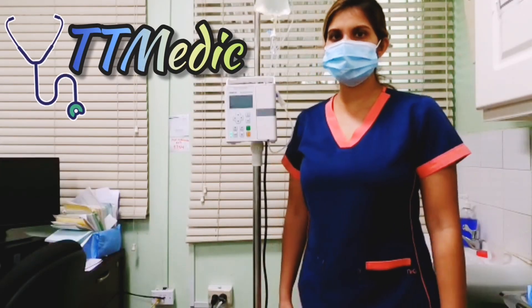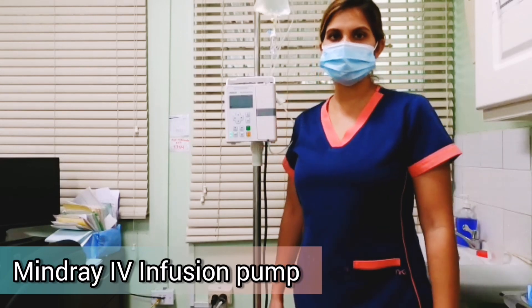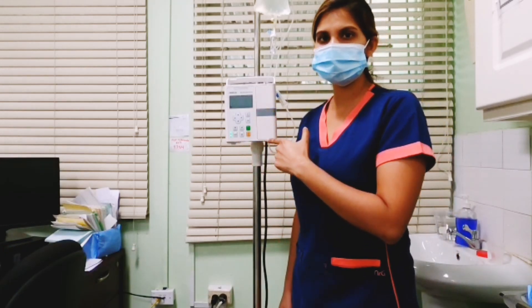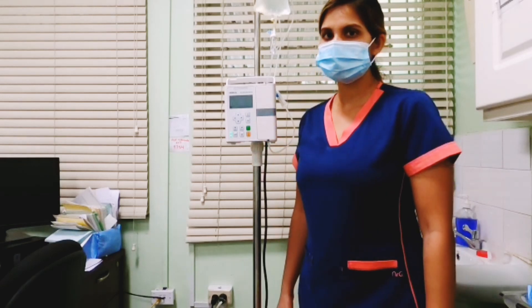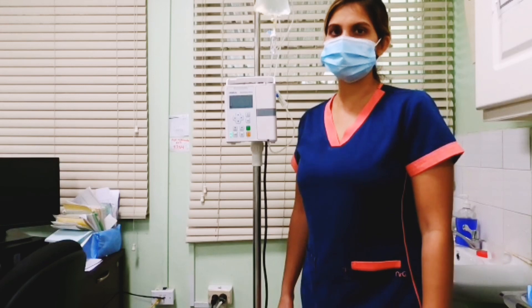Hi, good day. Today we're going to give an instructional video on the Mindray IV infusion pump. We're going to talk about the different functions that they have available, as well as those functions that are needed for IV infusion and drug administration.